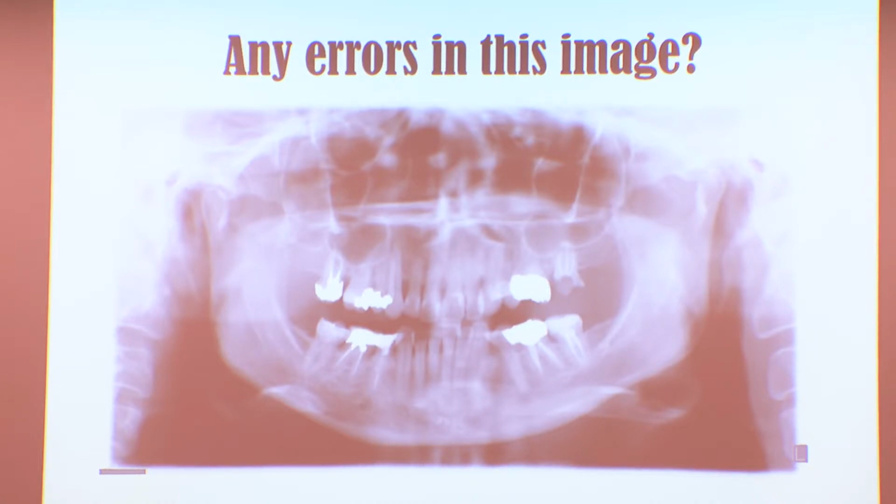That's usually because the patient might have been too close and their shoulders are up like this. If their shoulders are really tight and up by their ears, that automatically brings the hyoid up. So you just tell them to relax their shoulders after you get them all positioned. Sometimes I just run my fingers on their shoulders, because sometimes they're nervous and they're standing all tight like that, so you just relax them a little bit.